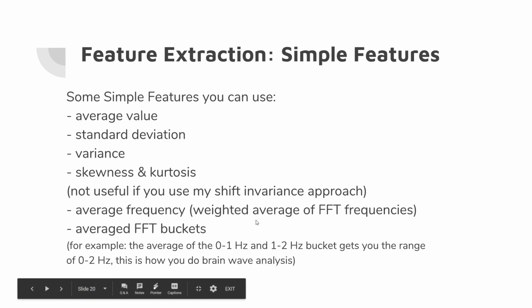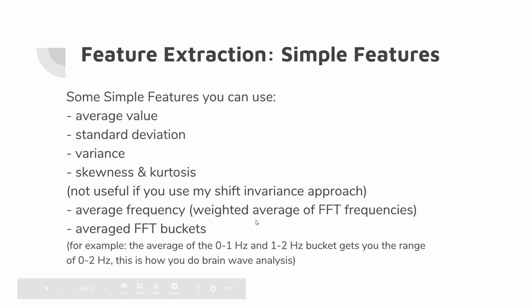So let's move away from the fast Fourier transform for a little while, and let's dig a little bit deeper into feature extraction and talk about what kind of features you can use. Now, the vast majority of the features here are not really going to be very useful in most applications, because a lot of the time you end up taking the signal and scaling it between the minimum and the maximum anyway in order to perform feature scaling.